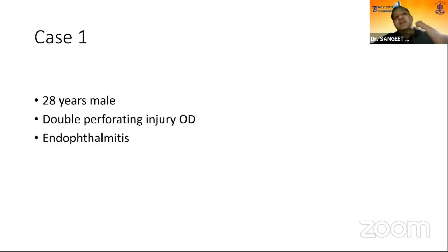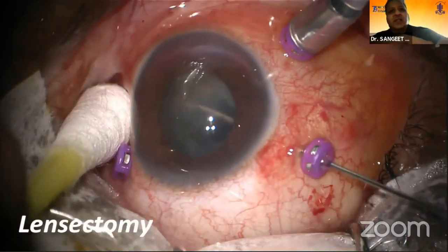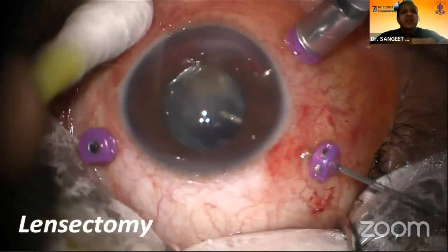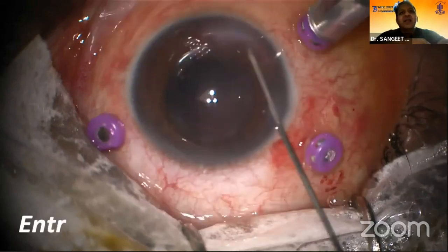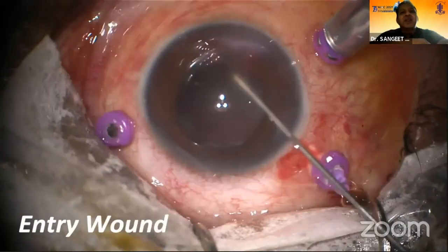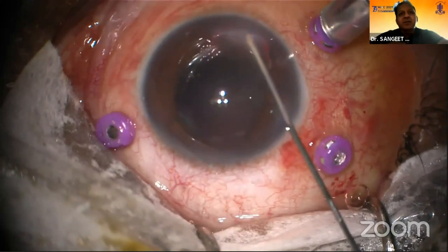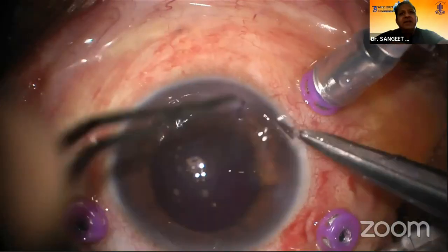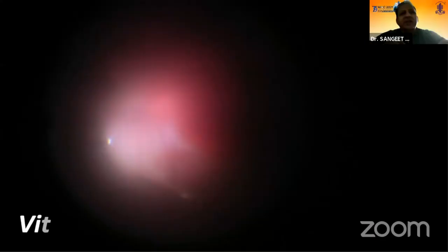I'll just present this case of a 28-year-old male who had a double perforating injury in the right eye. You see here I'm cleaning the lens and the exudates in the anterior chamber. And once the AC is cleaned, this entry wound was sutured. And after that, vitrectomy was done. All the vitreous hemorrhage and the exudates were removed.